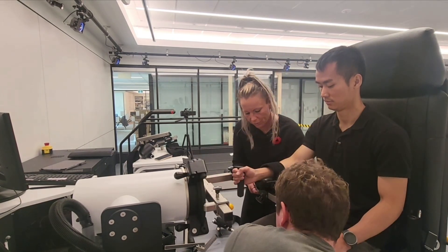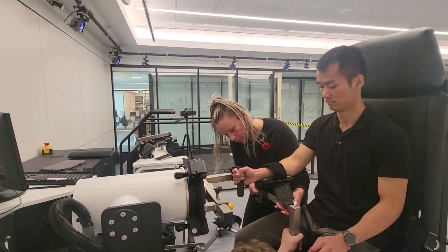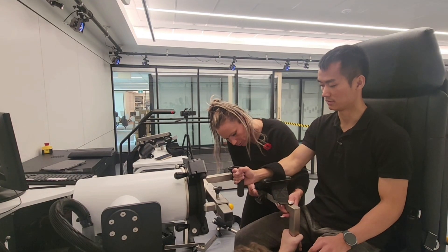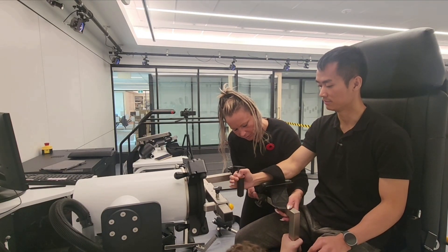I'll hold it for you so it doesn't drop. Probably just a little bit. Yeah, just a little. About there? Oh yeah, that's good.